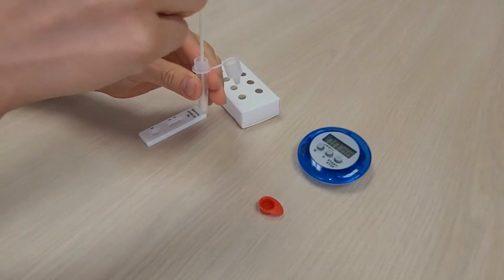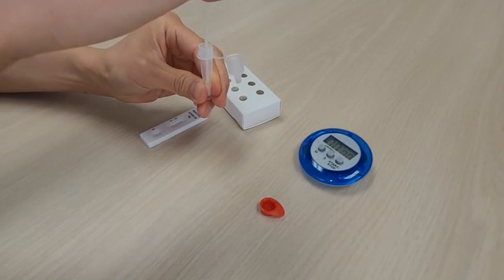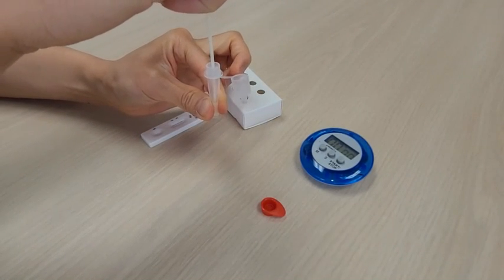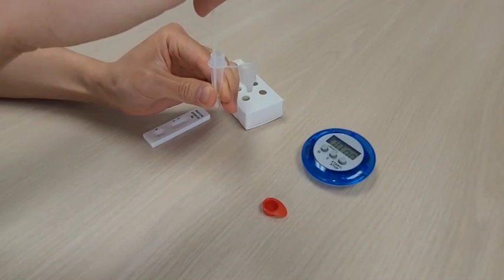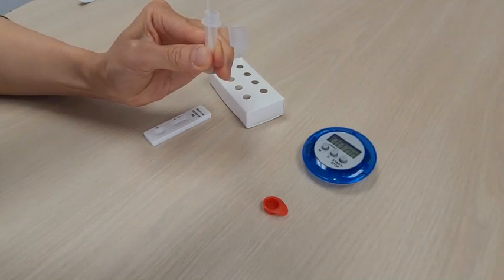Place the swab into the extraction buffer tube. Rotate the swab for approximately 10 seconds while pressing the swab head against the inside of the extraction buffer tube. Remove the swab while squeezing the extraction buffer tube to expel as much liquid as possible from the swab.